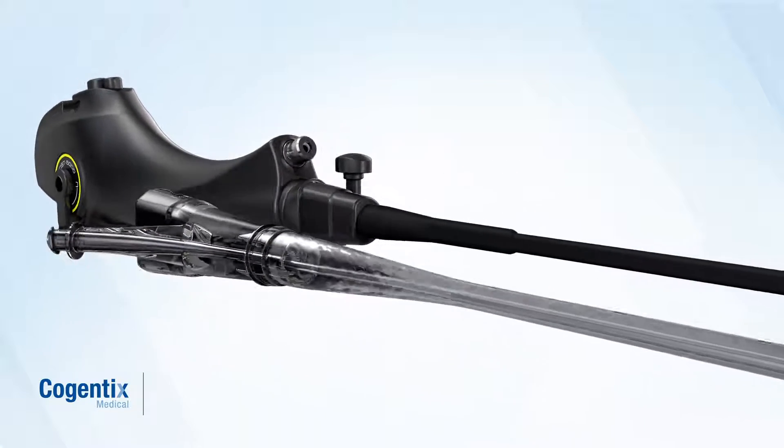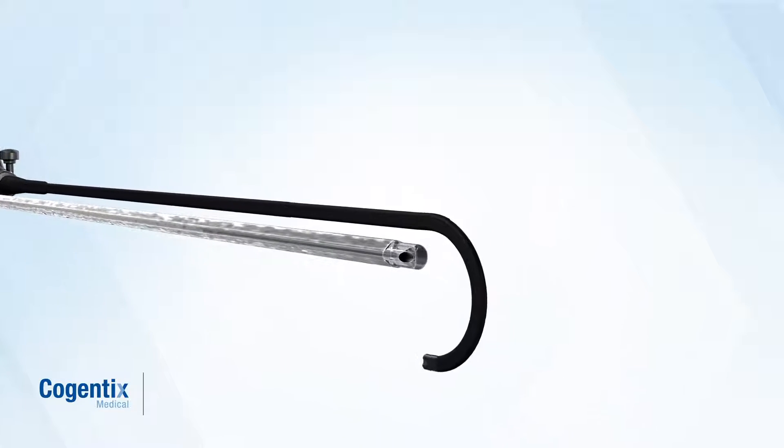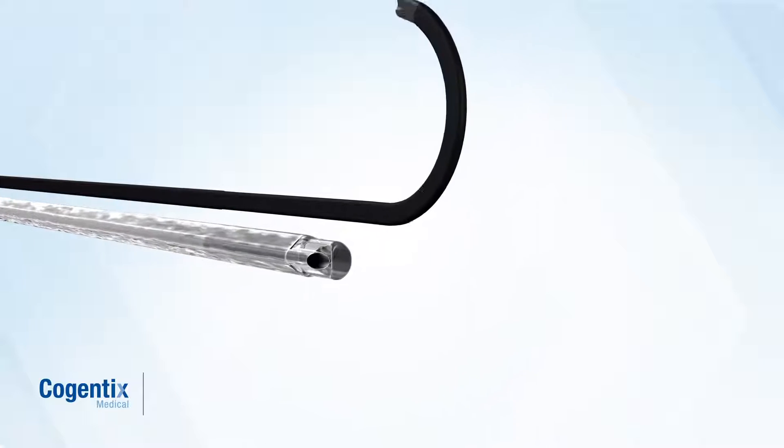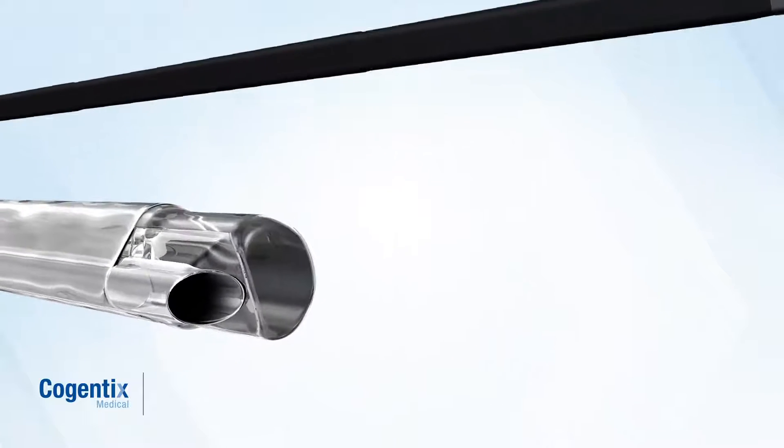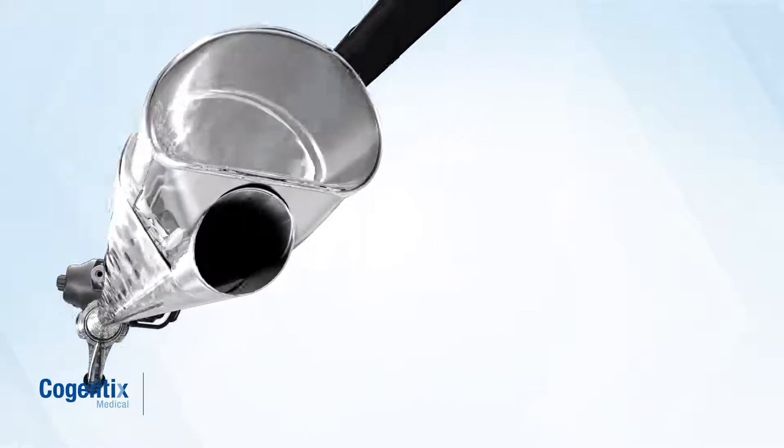Only the Endosheath System uses a sterile, single-use sheath that creates a protective barrier between the patient and the scope. This eliminates the need for cumbersome, lengthy sterilization procedures and helps ensure you have access to sterile technology when you need it.